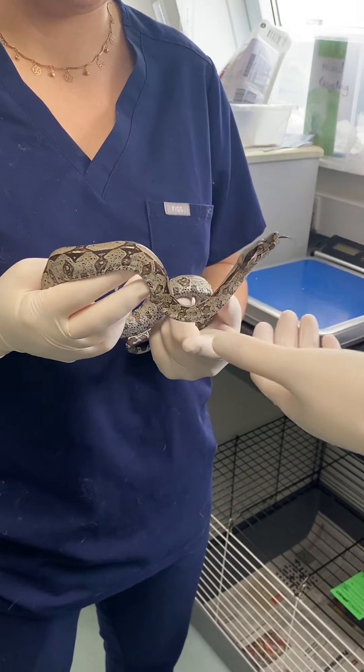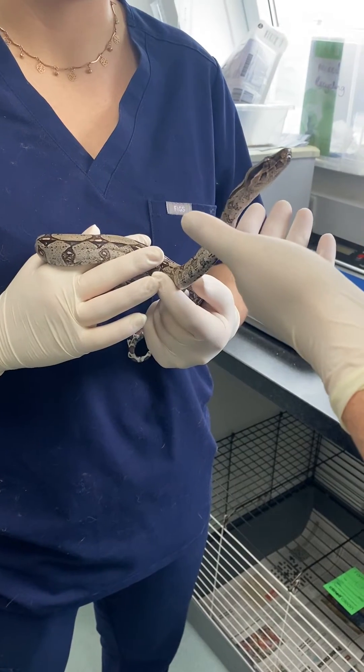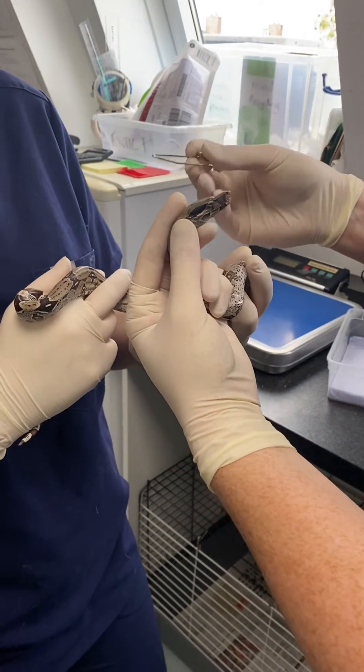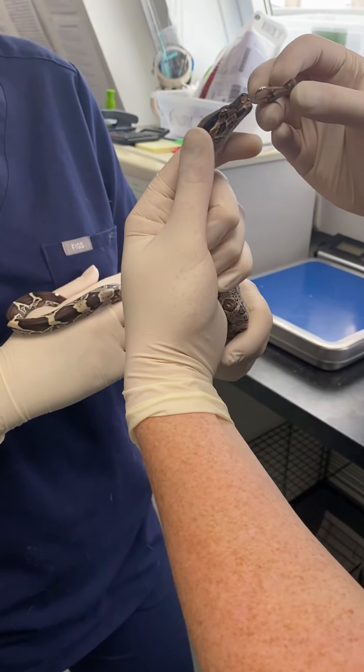These guys are coming with parasites so we're going to be worming them, but you can use stomach tubing for syringe feeding and giving them fluids as well. Heather's holding him, supporting his body, and I'm just going to support the head. We've got these lovely little metal gags that we can pop in his mouth, and everything that I need is ready and close at hand.